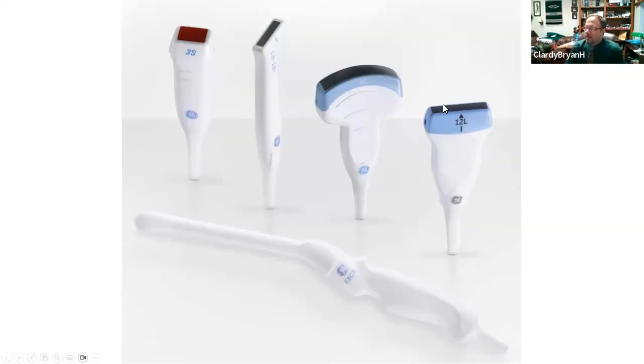And that's going to give you data of stuff that's up close. You're not going to be able to see very far in. If you look at that curvilinear probe right there, that's an abdominal probe, one we frequently use for obstetrics. You can see almost all the way to the table underneath the patient with that, because it's a much lower frequency probe. That's a 4 megahertz probe versus the 12 megahertz probe. And then there's some other issues with probes, like are they cardiac or not, and are they better at determining motion, that I think are probably beyond the scope of this particular program.